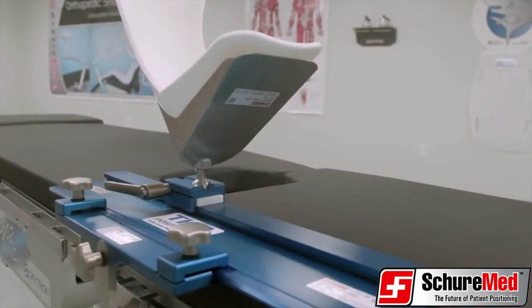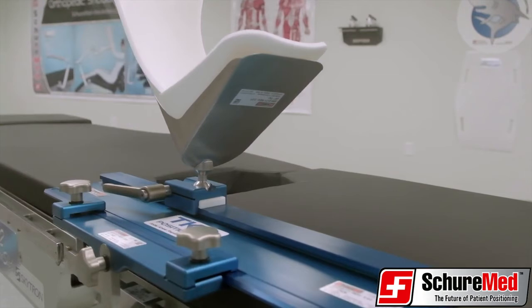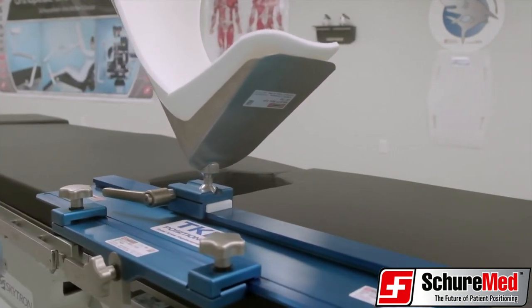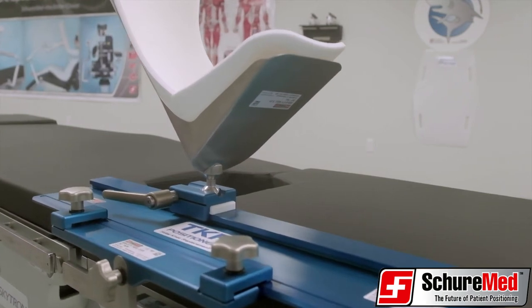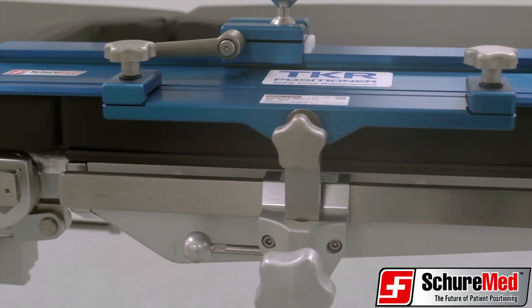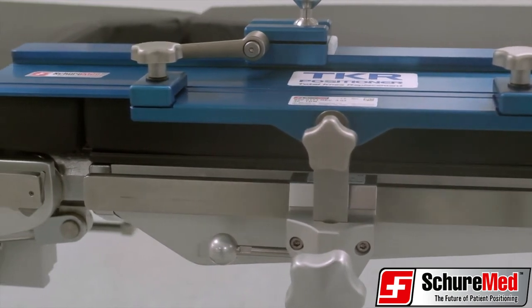SureMed's TKR is manufactured in the United States and is available in both 24 and 30 inch lengths. Each version includes a custom sterilization tray with specific compartments for each item and comes with a two-year manufacturer's warranty.